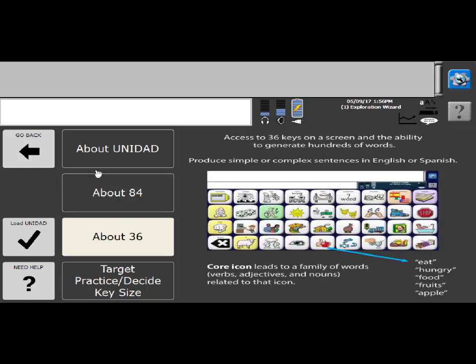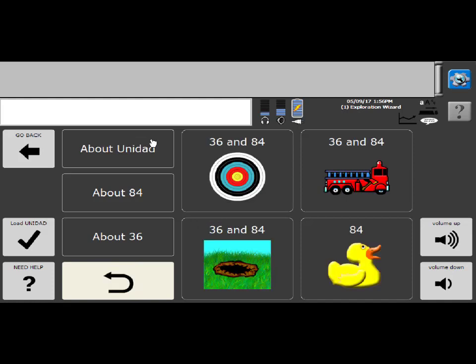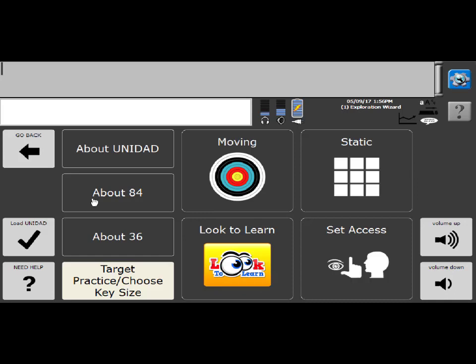Okay, so 36 keys on the screen and there is both an English and a Spanish side of the program. If you need to figure out which key size is going to work out best, you can select the target practice, choose key size, and there are a variety of different activities you can go through. So there is a moving targets activity, bullseye, train, whack-a-mole, and the ducks.